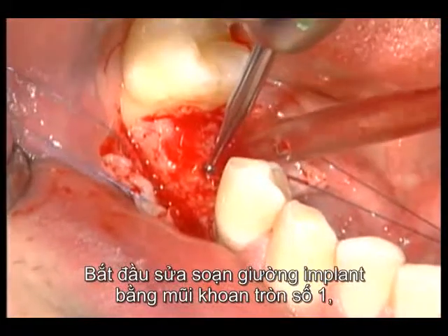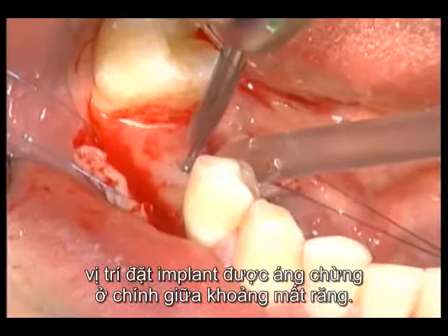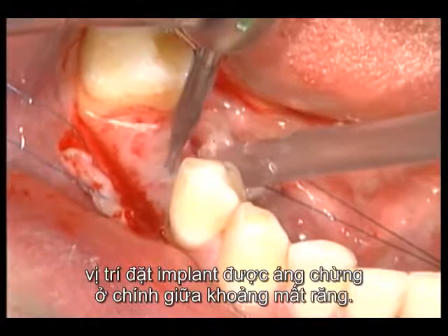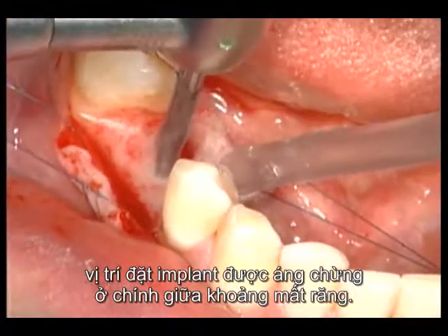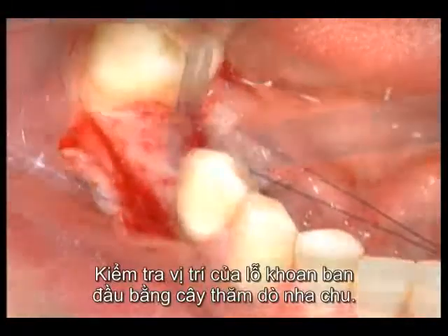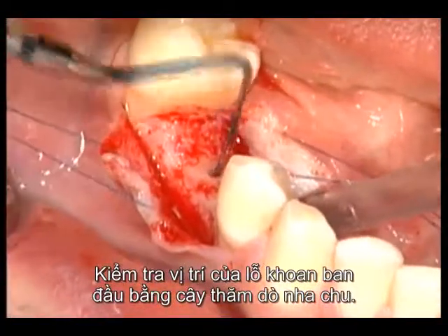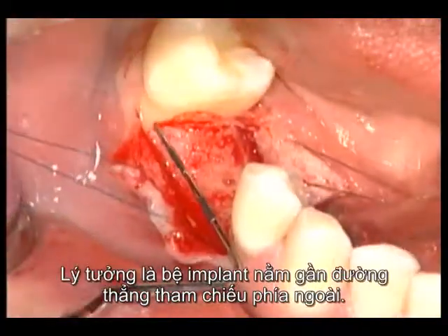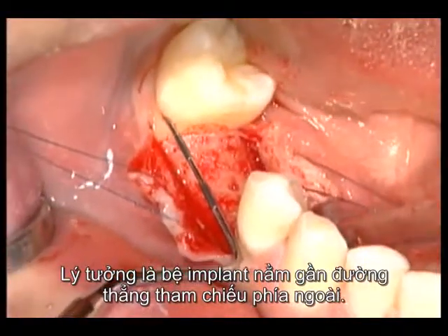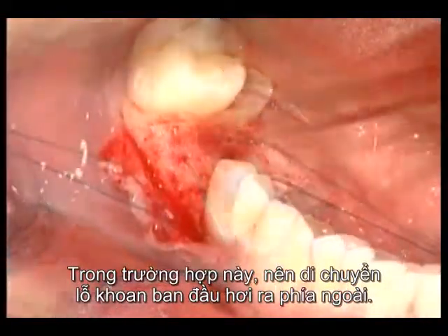The preparation of the implant bed is started with a number 1 round burr. The position of the implant is chosen approximately in the middle of the gap. The position of the first preparation is checked with a periodontal probe. Ideally, the implant shoulder should be close to the reference line applied buccally. Here, the first preparation should be moved slightly more to the buccal aspect.